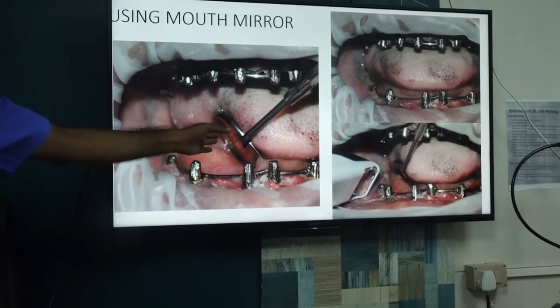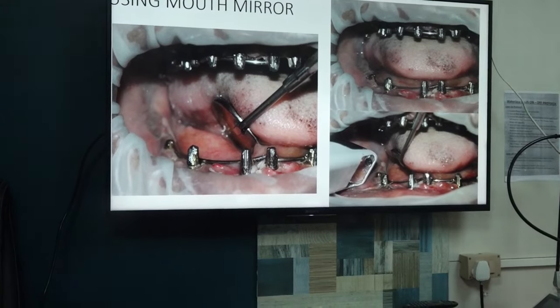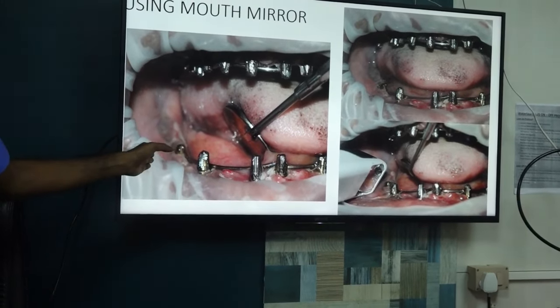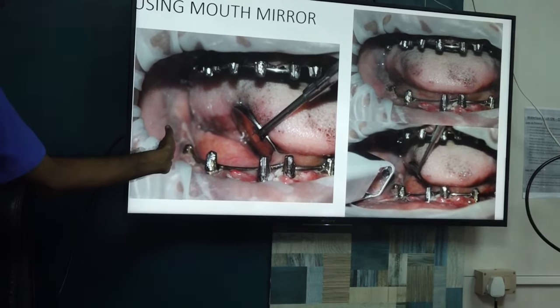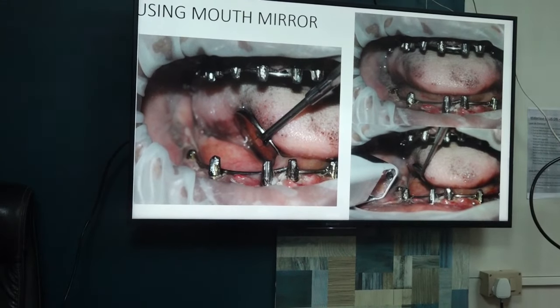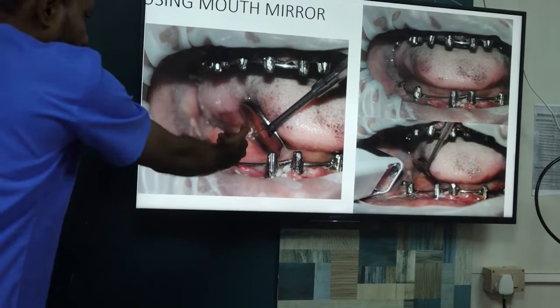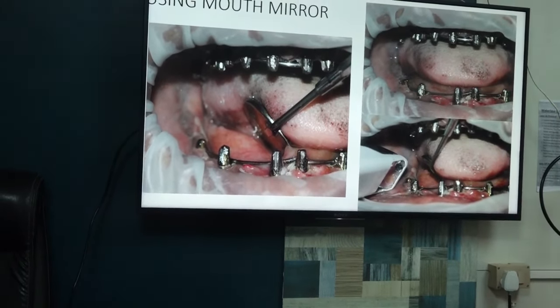Then you have to use the mouth mirror when it comes to the molar area, lingually. When you scan buccally, you have to do this, right? When you keep the scanner here, the tongue and floor of the mouth will come and produce double scanning of the movable tissues. When you keep the scanner here, there is actually no need for the mouth mirror. See here.